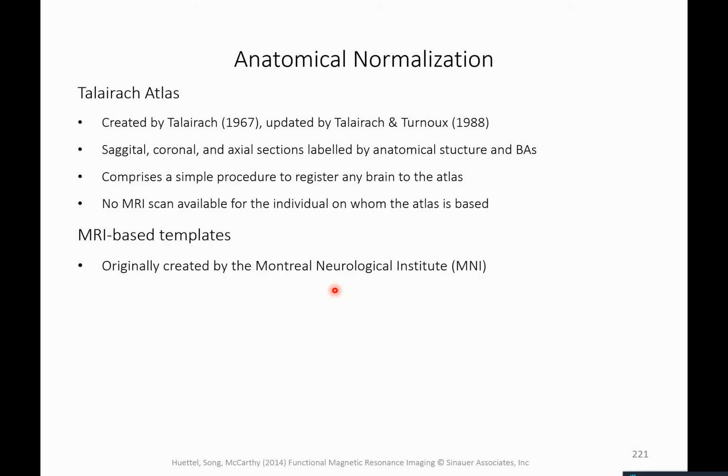But once you had imaging, you could, of course, normalize the data that you have, the MRI data, by stretching or shearing it into the size of the Talairach space sub-boxes. And this you can essentially do based on templates.